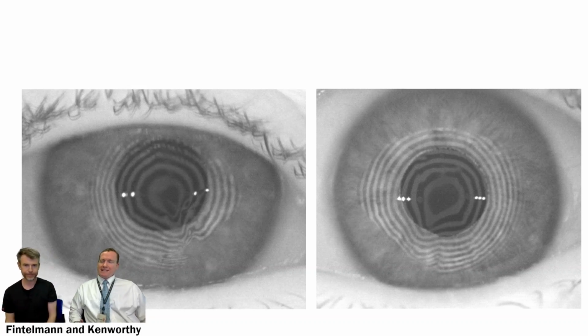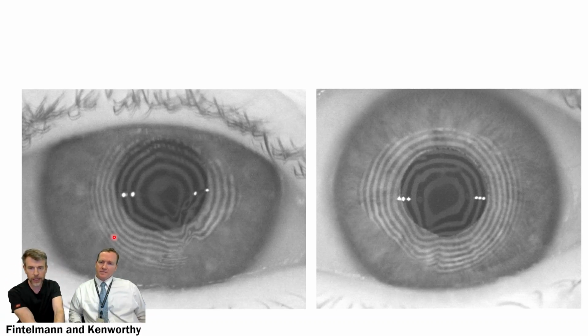Would that normally be done at the same time or at different periods of time? And why would an AK later be added on a patient with RK? Usually done at the same time. I've also seen patients where the astigmatism was changed, where at some point you just end up with AKs all around. The challenge with AK and RK is that the incisions don't always stay closed.